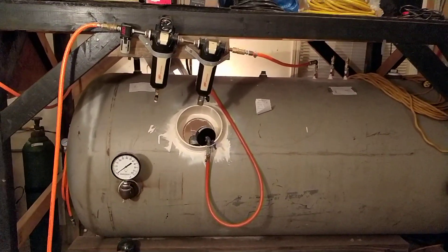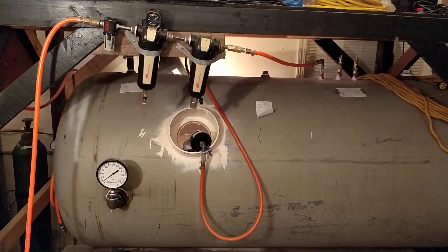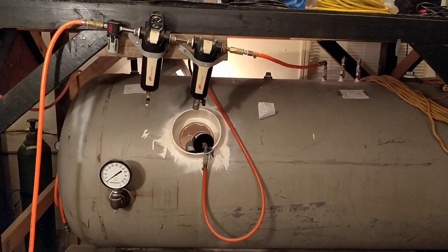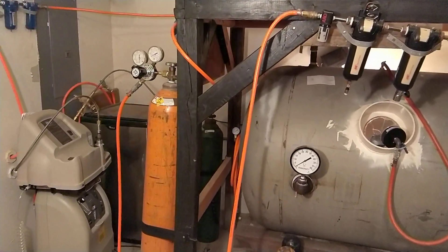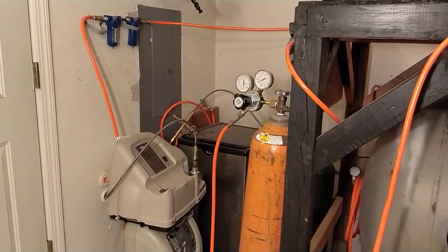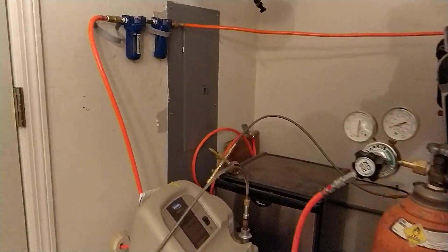So with that said, this chamber is operational and it's pretty fun to play around with. It has a lot of gadgets, as you can see. It can look overwhelming, but it really isn't. I'll start off with how it's pressurized.